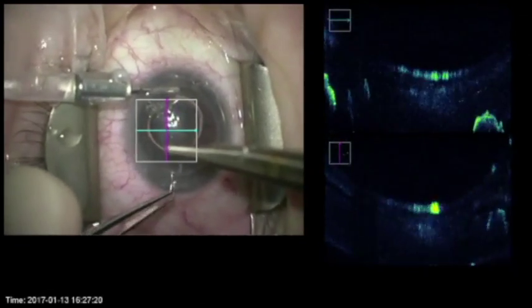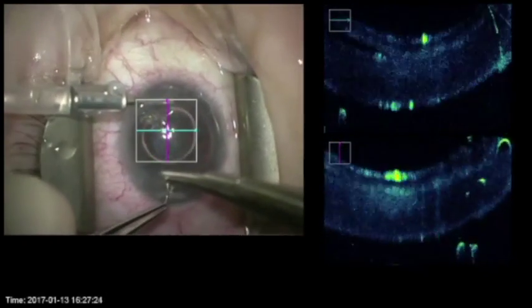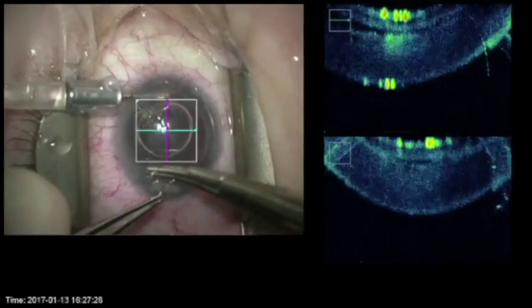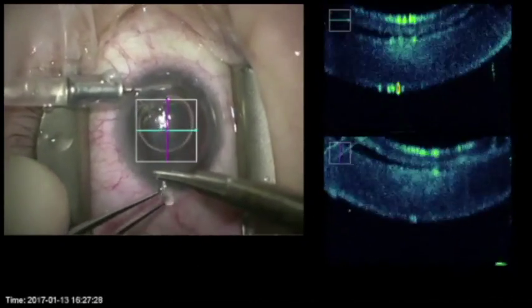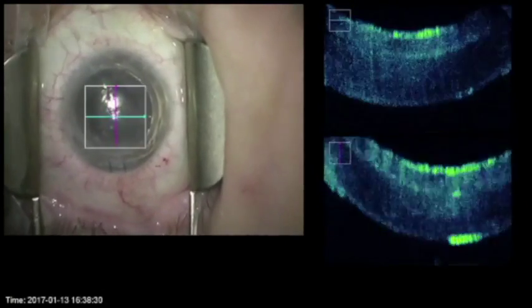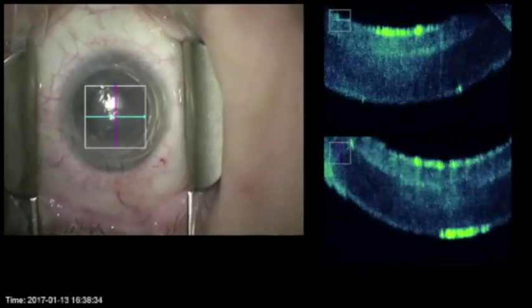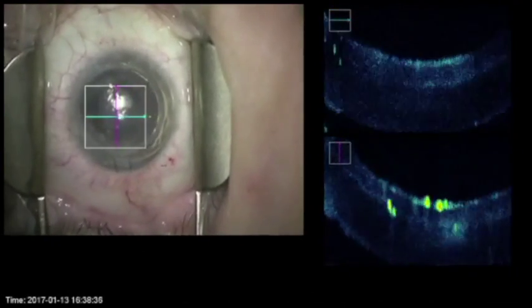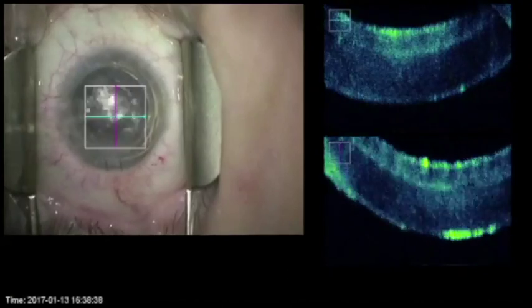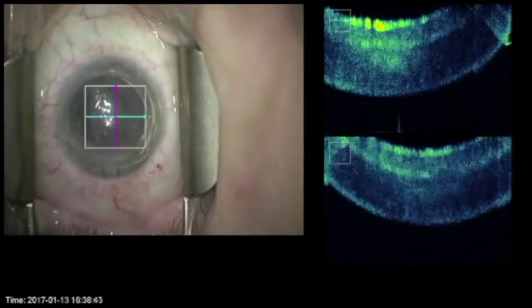Following this, the corneal edge is sutured. And then a large air bubble is placed. I check people 30 minutes after surgery, and we'll decompress the anterior chamber if necessary. This patient has an inferior surgical PI present.